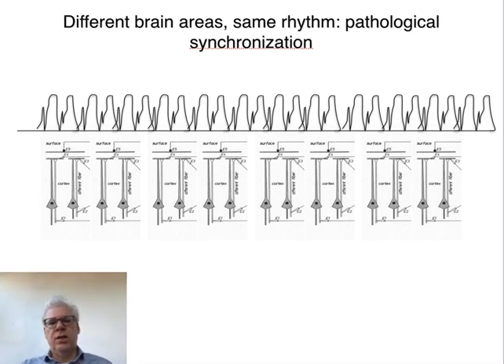But the interesting observation is that in many patients with epilepsy, we may also find subtle discharges in between the seizures. So they don't have the seizure, but if you record the EEG, now and then you find a short duration of abnormal synchrony. Too short to give clinical signs or symptoms, too short to generate a seizure, but it is a signature of epilepsy. So it's a very specific sign for patients with epilepsy. So you could observe, for instance, an isolated spike wave discharge in a particular patient, but not a whole run.